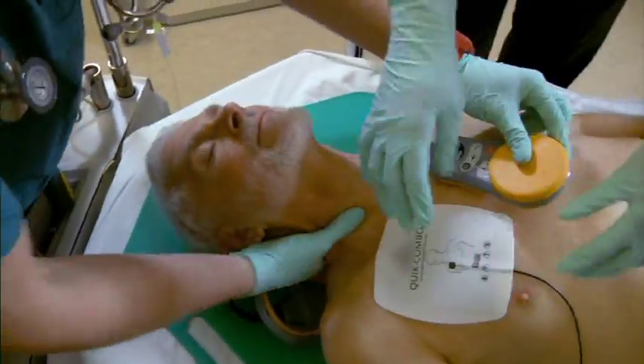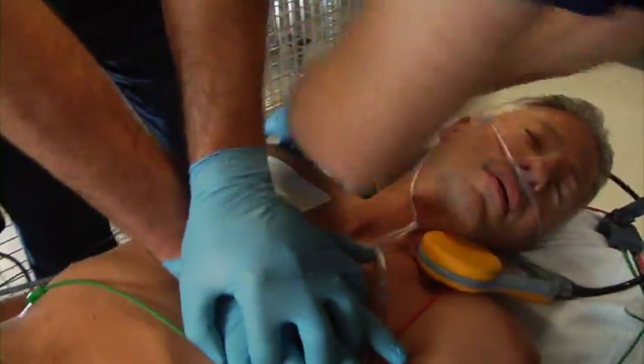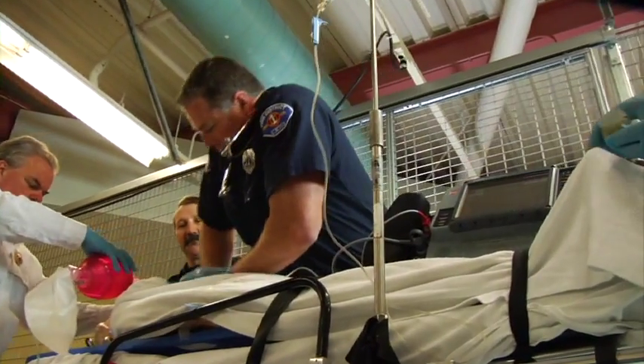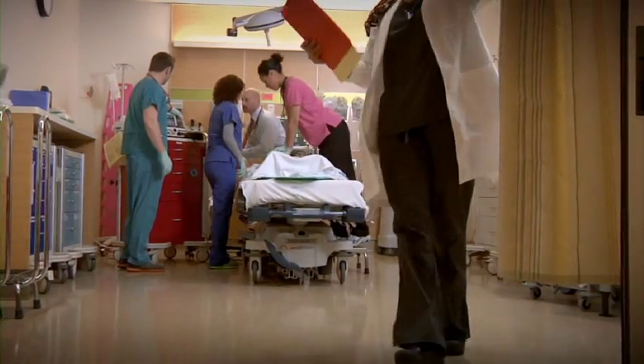TrueCPR has been designed for use on hospital beds, stretchers, gurneys, and in ambulances. It is compatible with common patient-worn or implanted metal, such as jewelry, ICDs, or pacemakers. It is intended for use by trained providers on patients who are 8 years of age or older.